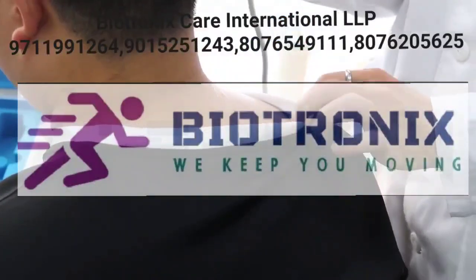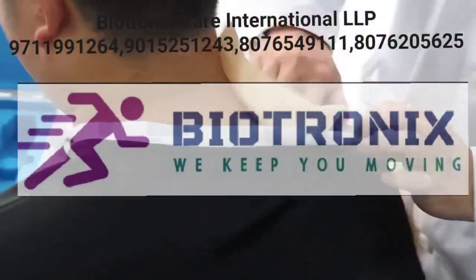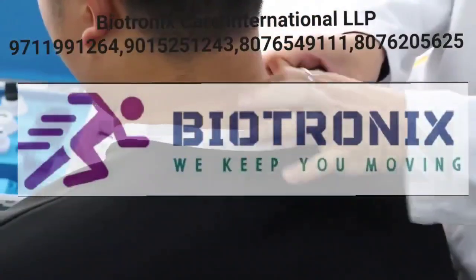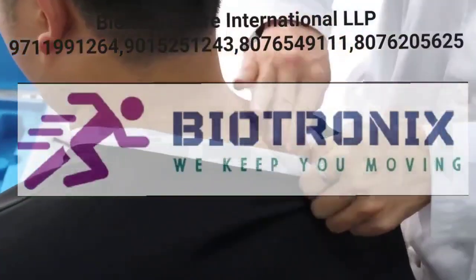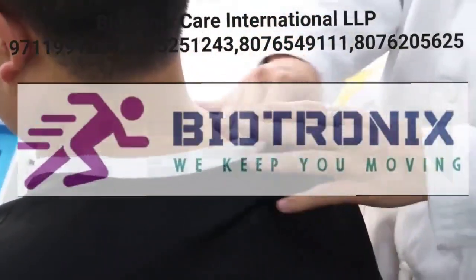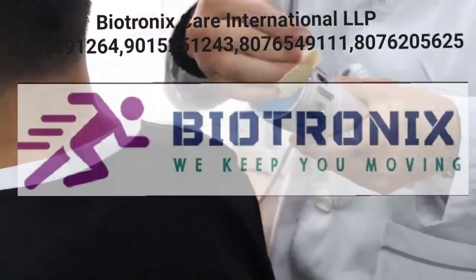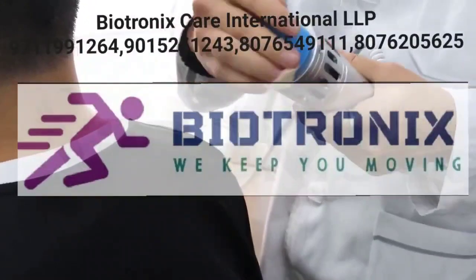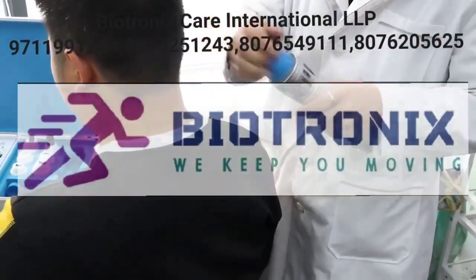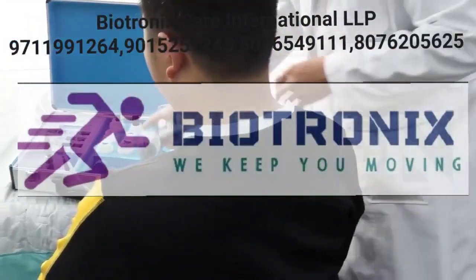So after the treatment, we can clean up the gel. It's very easy to clean up the gel on your body and do the small massage on the area for the body. This is what we do. You can do the relaxation of the muscle for the body, and of course we need to clean up the tips. After the treatment, clean up the tips. No matter for the shoulder or for knee, for leg, for different area of body, it is the same way to do the treatment for the clients.